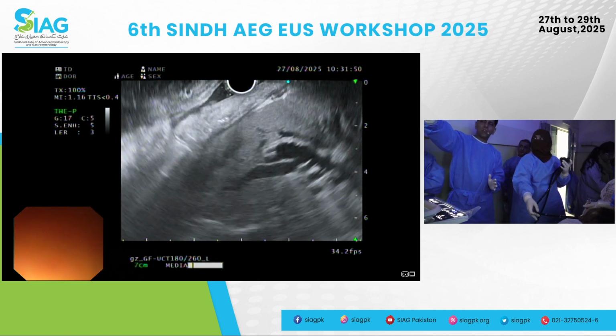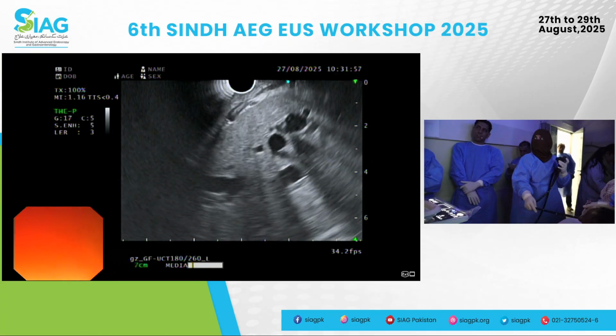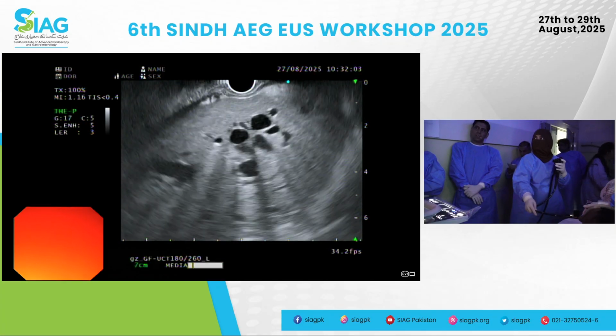Remember, getting 2/3 of the scope onto the right and 1/3 here. We need to get more hepatic parenchyma. A lot of central intrahepatic ductal dilatation. Suction, suction, suction. Tip up, please. Tip up, please. Good. Very good. Tip up. Still good, good, good. Excellent.